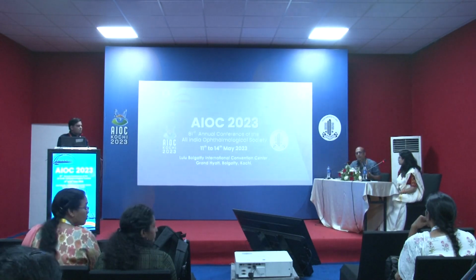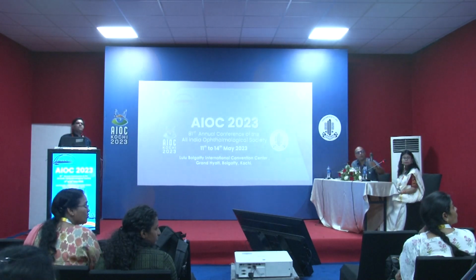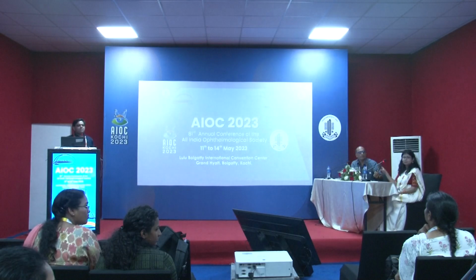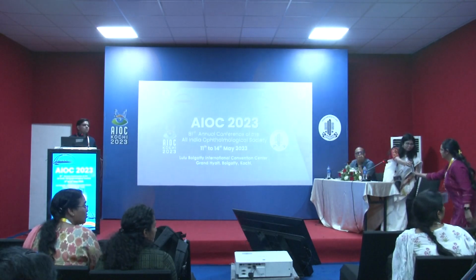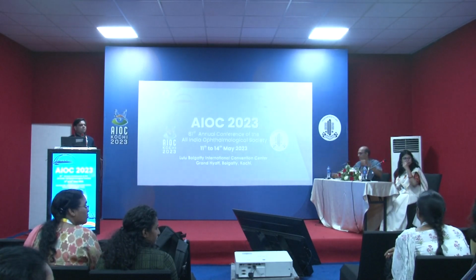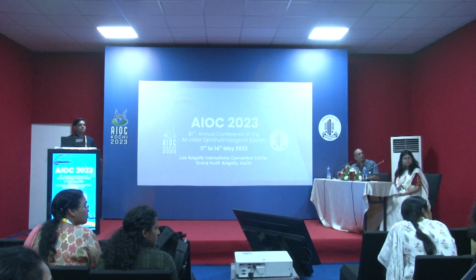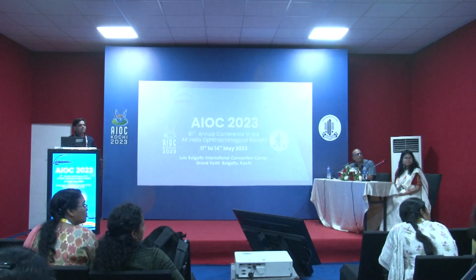And one small point, madam. Yes, yes. In thyroid eye disease, the muscles will be enlarged and the tendon will be spared. And basically, as you're a radiologist... Yes, right, ma'am. As ophthalmologists, what we look for in MRI is activity.